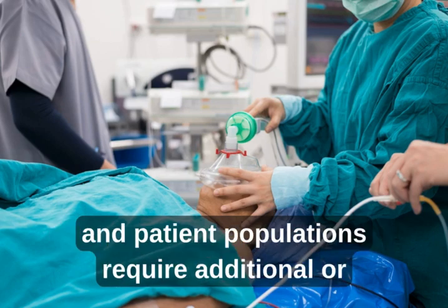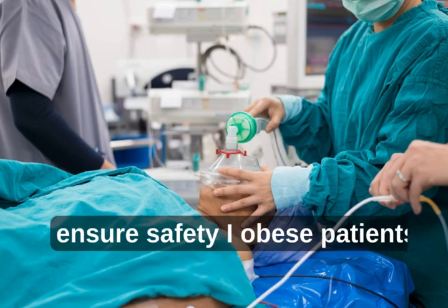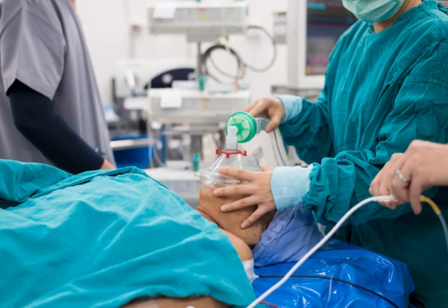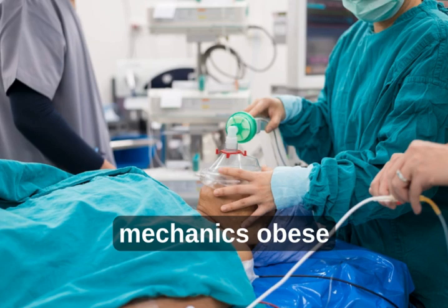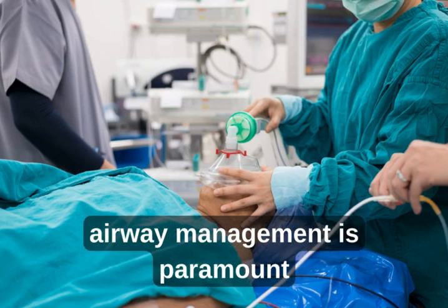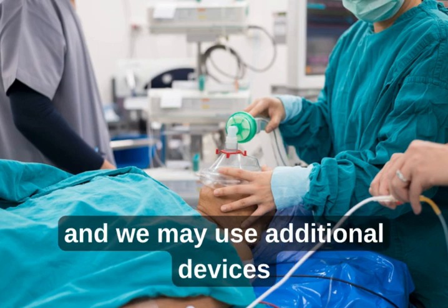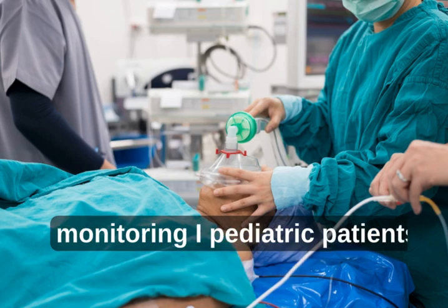6. Specialized monitoring in special cases. Certain surgeries and patient populations require additional or specialized monitoring techniques to ensure safety. Obese patients, due to their altered airway and respiratory mechanics, require more intensive monitoring. Airway management is paramount, and we may use additional devices like video laryngoscopes or airway pressure monitoring.